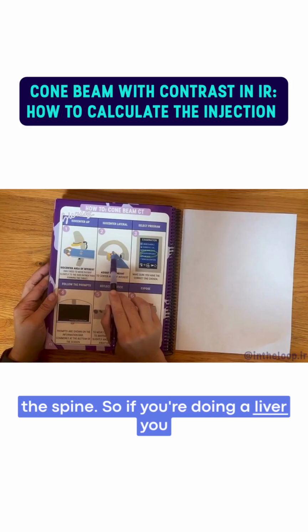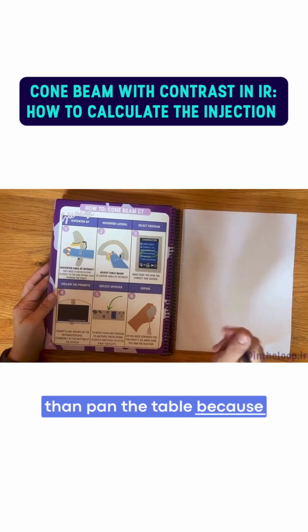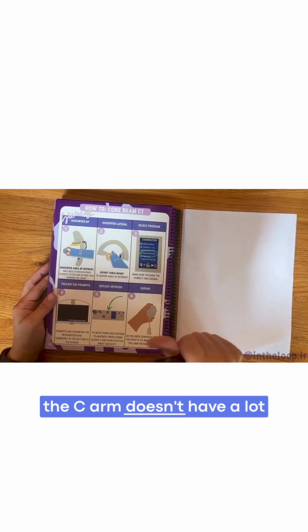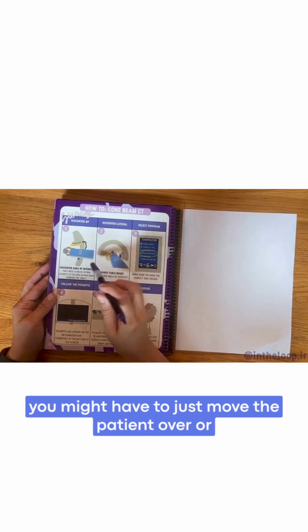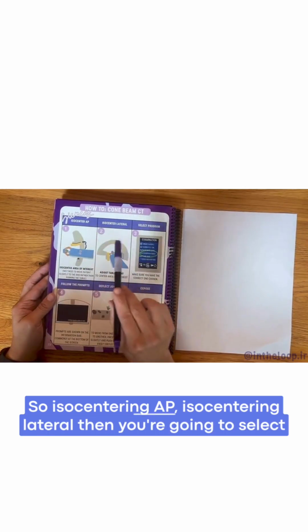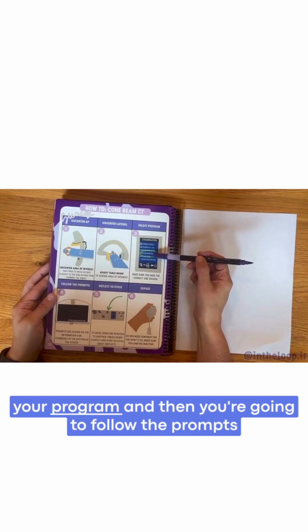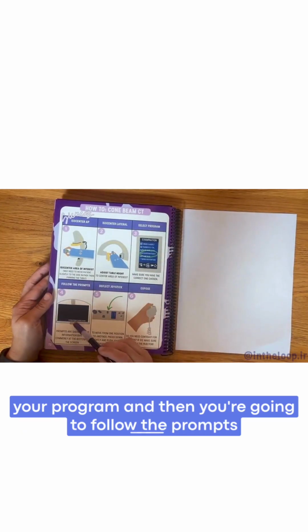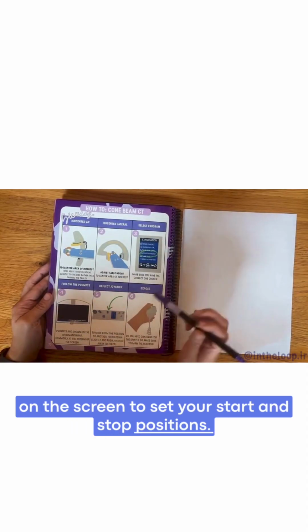If you're doing a liver, you may need to move the patient a little to the side rather than pan the table, because the C-arm doesn't have a lot of room to spin around in the IR suite. So you might have to just move the patient over, or you're not going to be able to set your parameters. So isocentering AP, isocentering lateral, then you're going to select your program, and then you're going to follow the prompts on the screen to set your start and stop positions.